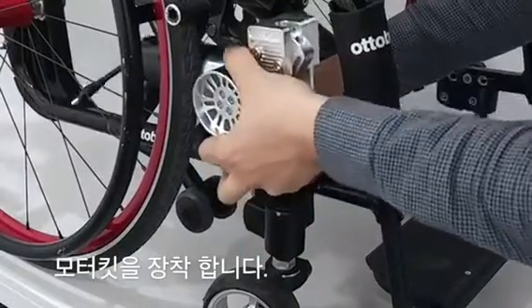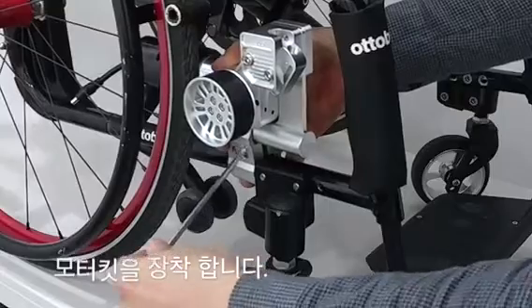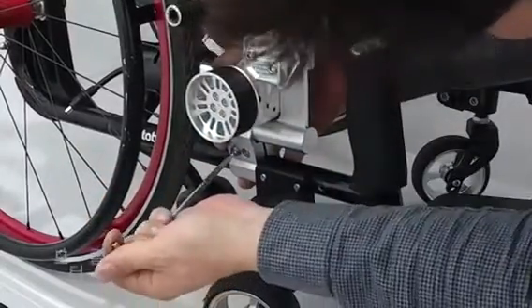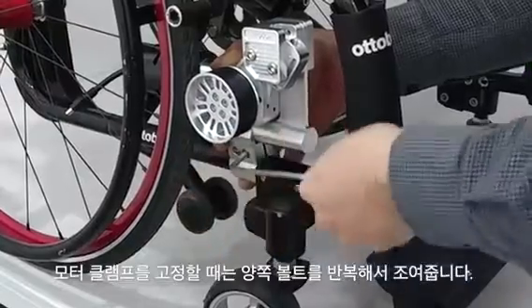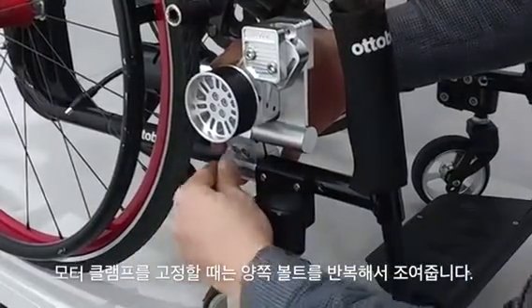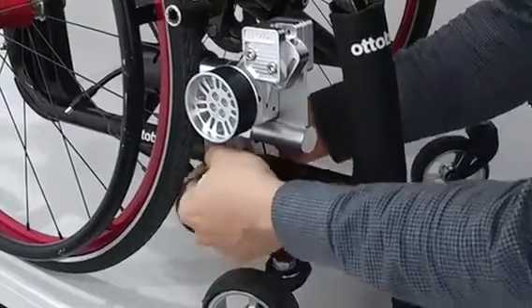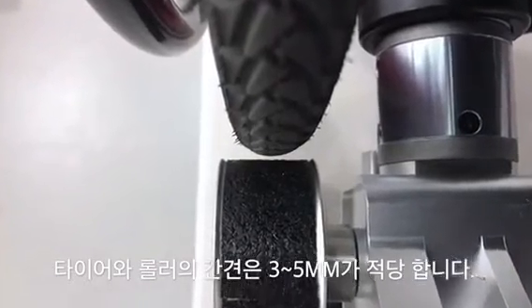Install the motor kit. When fixing the clamp, fasten both bolts repeatedly. The suitable space between the roller and the tire is about 3mm to 5mm.